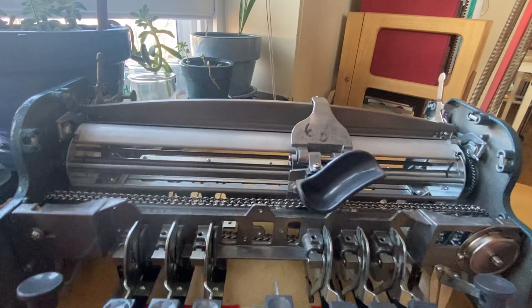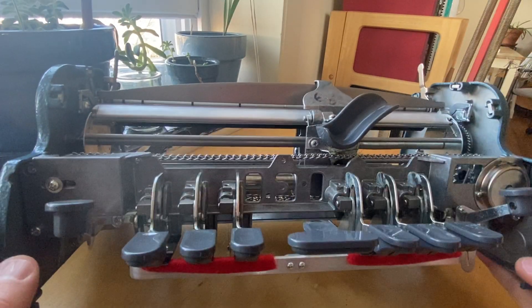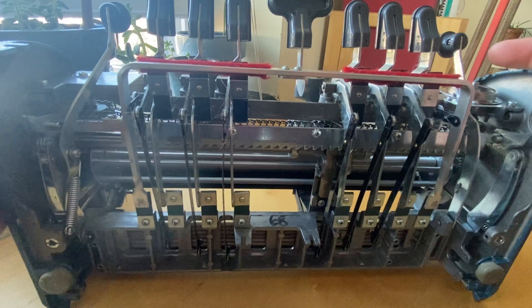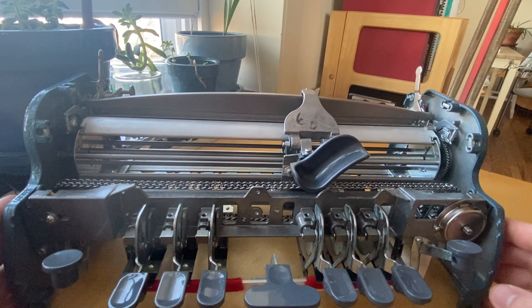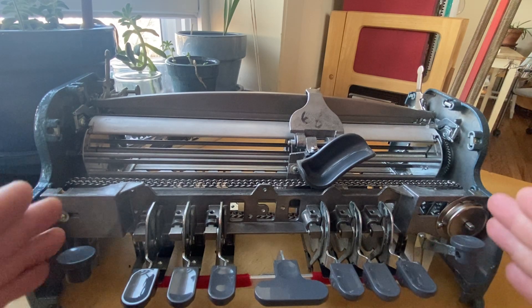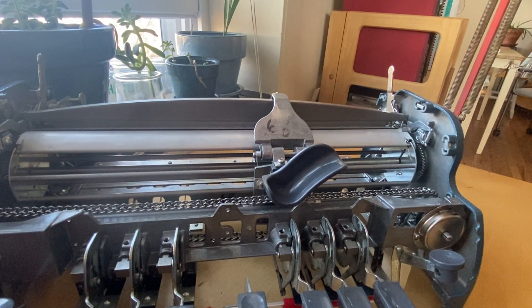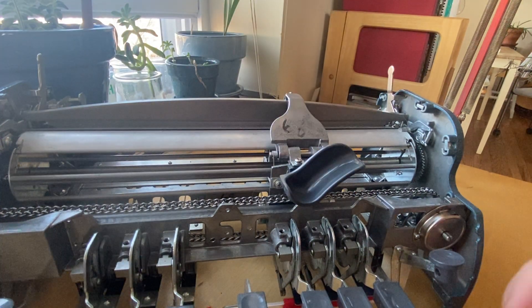We haven't really gotten a chance to talk about the drive chain, but maybe I should save that for another video. Briefly, the drive chain is a literal chain on two sprockets on either side, facing parallel as you are sitting at your Brailler. The embossing head is attached to this chain and that's what helps move it forward. It's also mounted on the carriage tube.